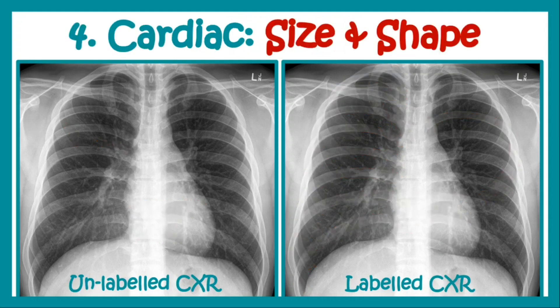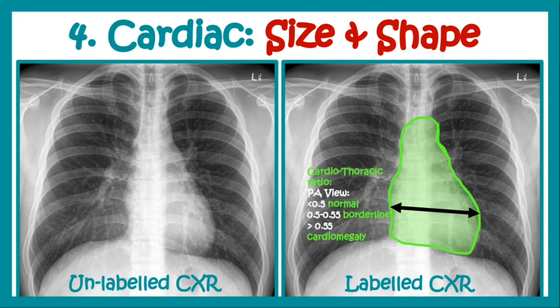Now we go for cardiac size and shape. For the size we determine the cardiothoracic ratio. We take the greatest diameter of the heart as indicated by the black arrow, then we take the thoracic diameter and take a ratio. In PA view, a cardiothoracic ratio of less than 0.5 is normal, 0.5 to 0.55 is borderline, and more than 0.55 indicates cardiomegaly. Now find the shadow of the heart and determine your cardiothoracic ratio.